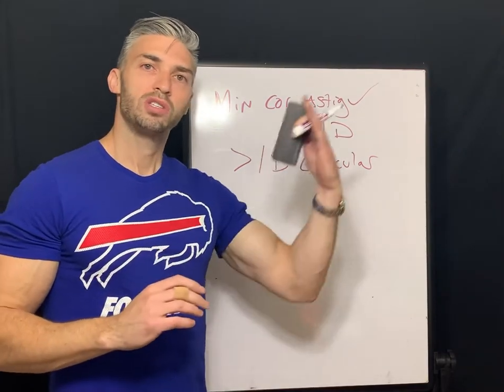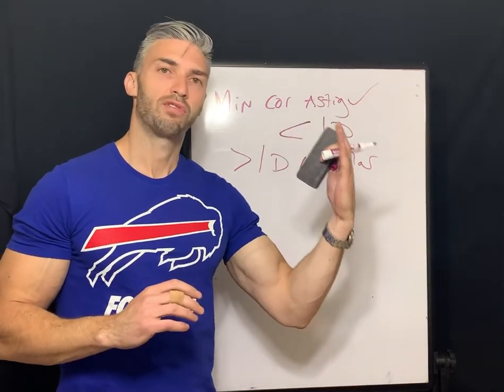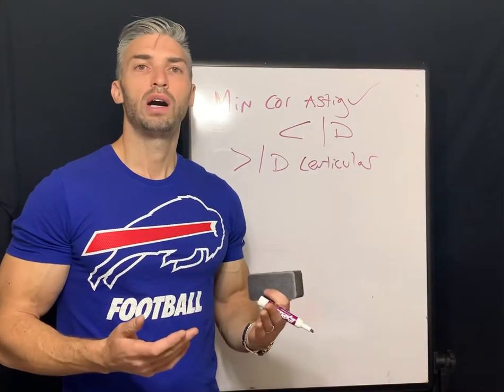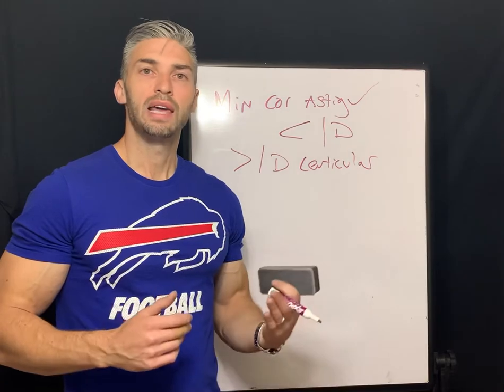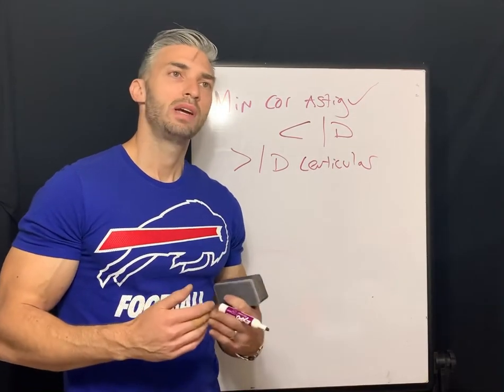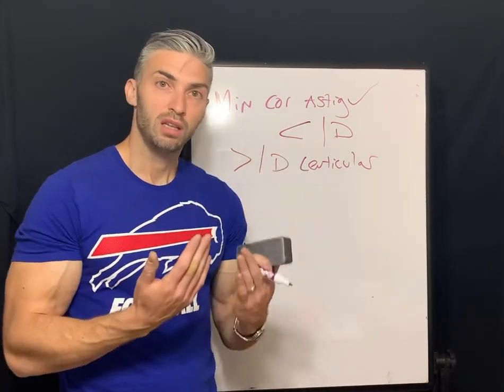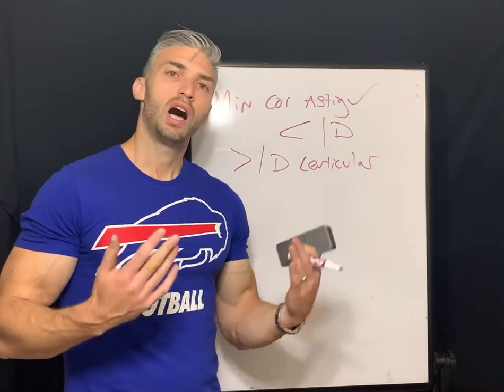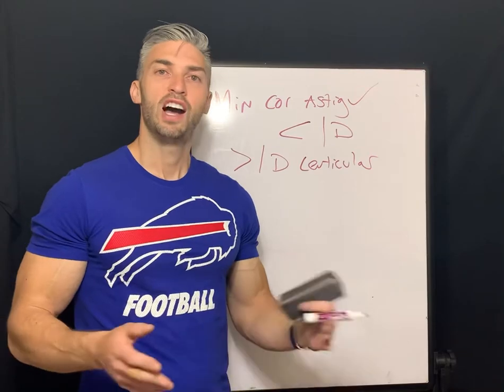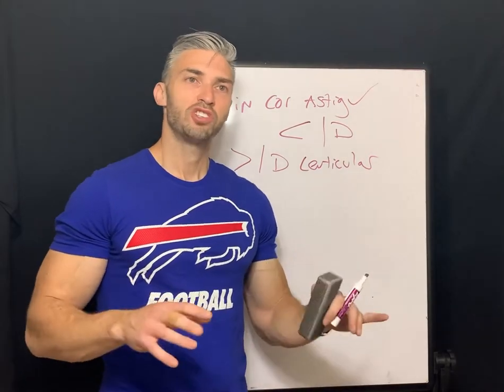But with the front surface toric, since we put it on the front, it doesn't stabilize as well. So you really need that weight of the prism on the lens. It's usually base down prism. It'll cause the lens to ride low, right? Because normally we want gas permeable lenses to ride a little high with a lid attachment. Again, I digress.